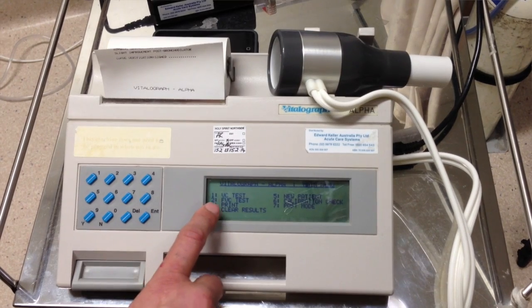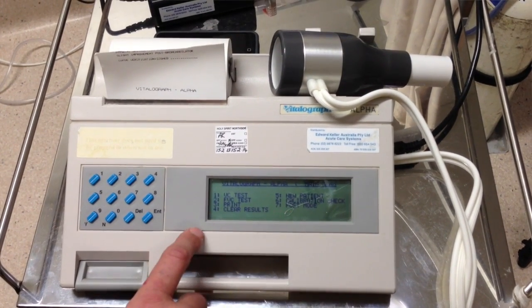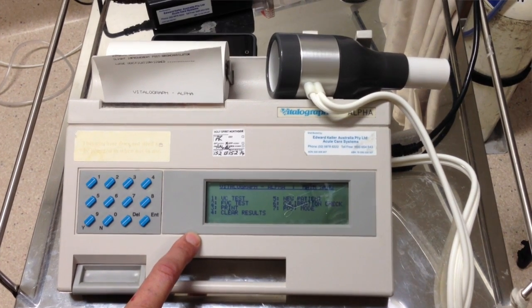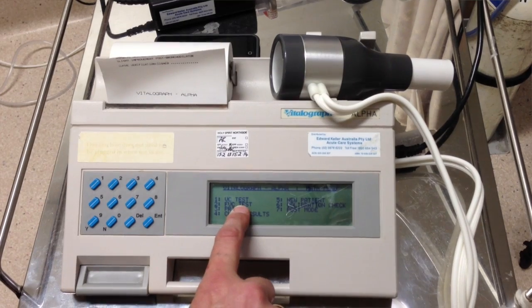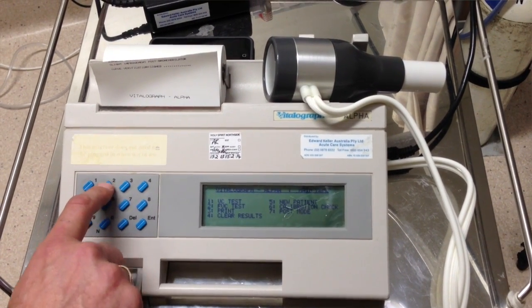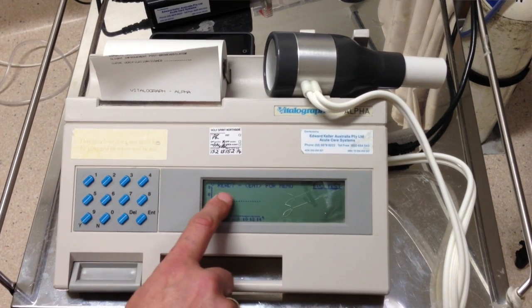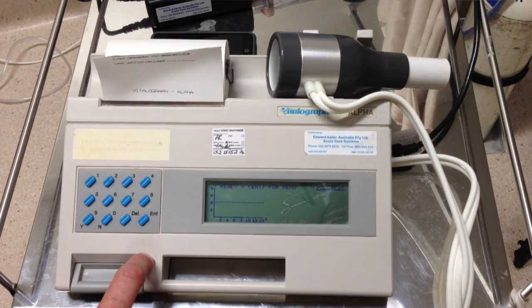This is the good page — it gives you a list of seven options of what you want to do. We want to do the FVC test, the forced vital capacity test, which corresponds to number two. So I'll press number two. It tells me please wait, and then it will go to ready, and then I can do the test with the patient.